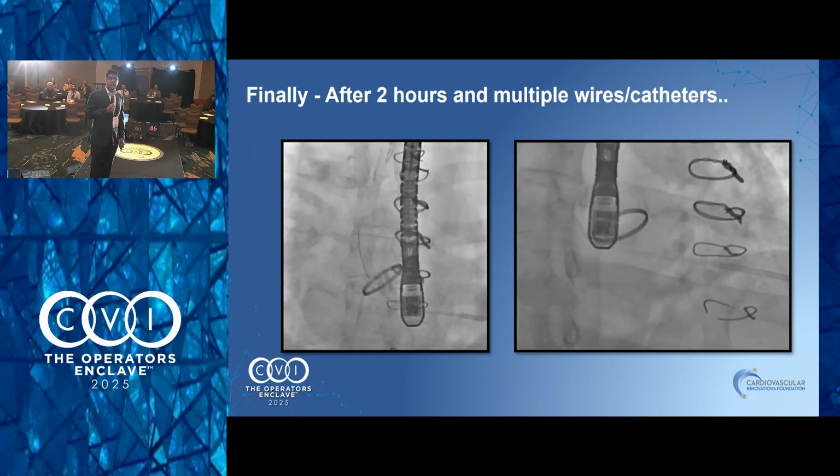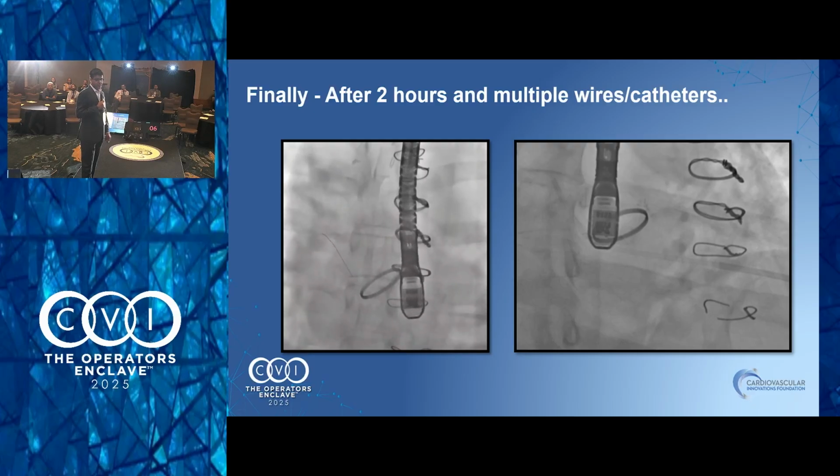Just a glide wire? It was a glide wire through an MP, but we had tried a bunch of different catheters, JR4 to make it stiffer in that area. I didn't want to go beyond 6 French. You can go to 8 French transapical to pick a bigger sheath, but I think it was a flow issue. It was just flopping around with that. Is that an 035 glide or an 018? This is an 018. Yeah, I like the 018. It's a little bit easier.